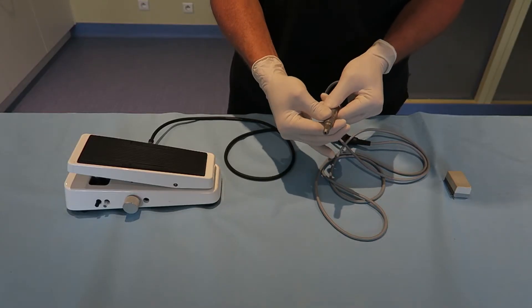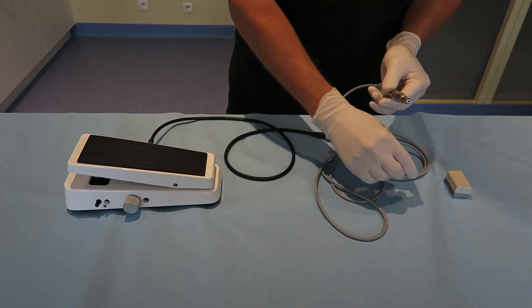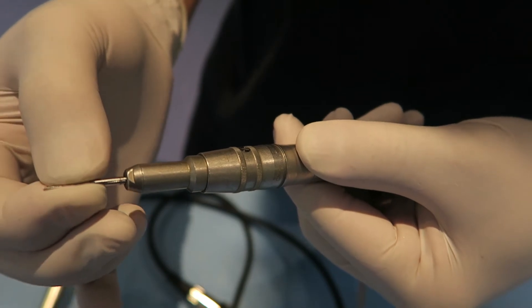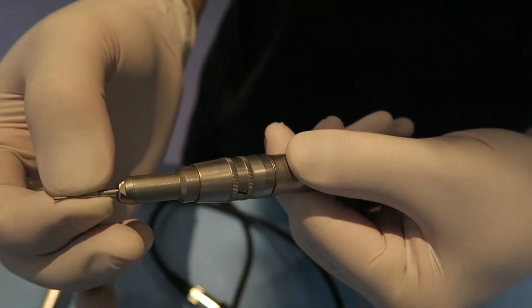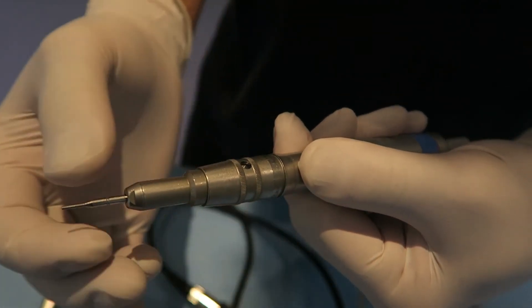The chuck of the handpiece can be locked and unlocked when you rotate it. To insert the punch, you need to unlock the chuck of the handpiece and slip the punch into it. Remember to lock the chuck again. To remove the punch, you just need to unlock the chuck and pull the punch up.